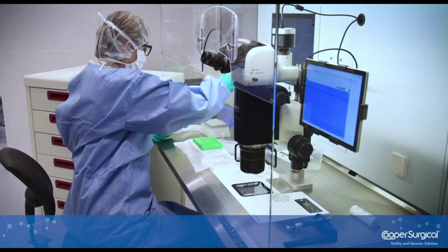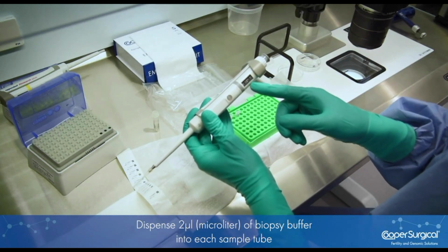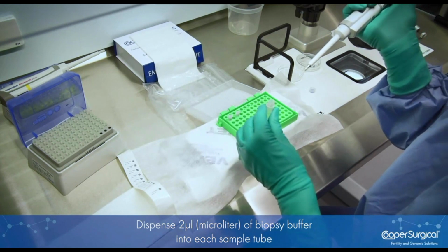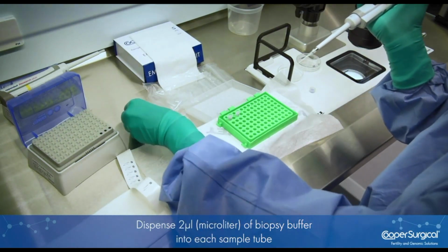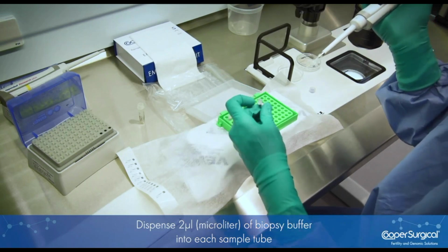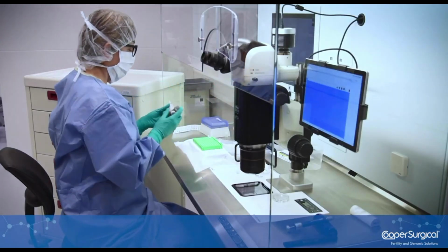Now we're going to prepare the tubes. We are going to add 2 microliters of buffer. For this, we also use tips that are DNA RNA free, and these tip boxes are only dedicated to the tubing work. One by one, we will add 2 microliters of the tubing fluid, and we will close the tube immediately after we have introduced the buffer.